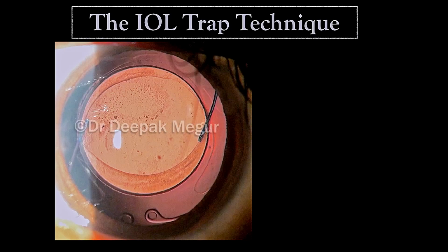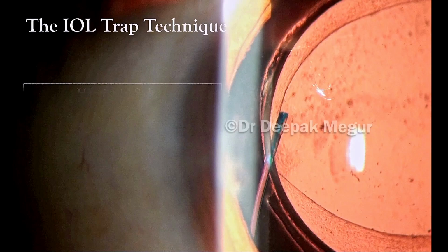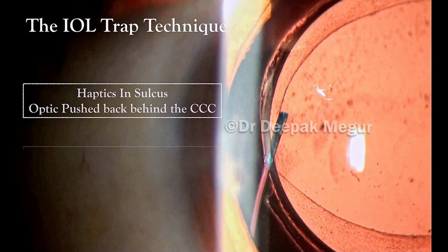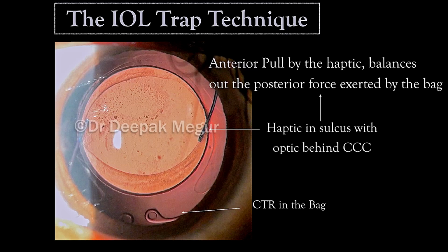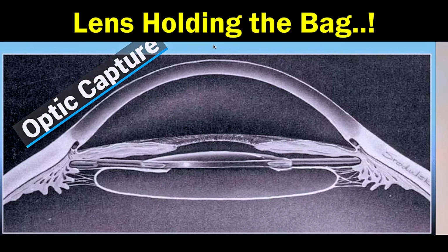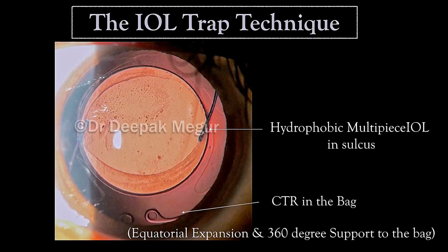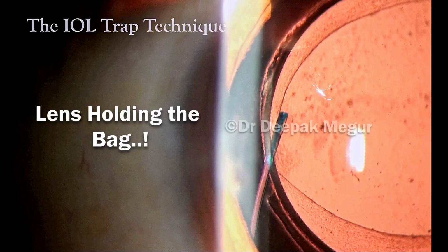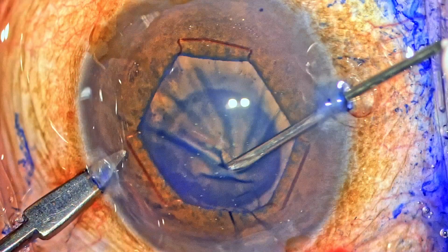The principle is you're going to use a CTR to provide 360 degrees support and stretch to the capsular bag, and then you're going to place the haptic in the sulcus, and the optic is being pushed back. The principle is that the lens is holding the bag rather than the other way around. Usually the capsular bag holds the lens and the CTR. In this case, we are hoping that the lens itself is going to support the bag for a longer duration of time. So this was a case where I was using the IOL Trap Technique.